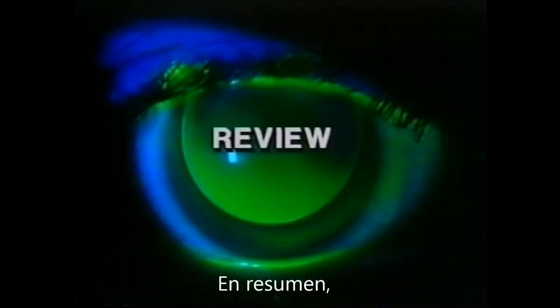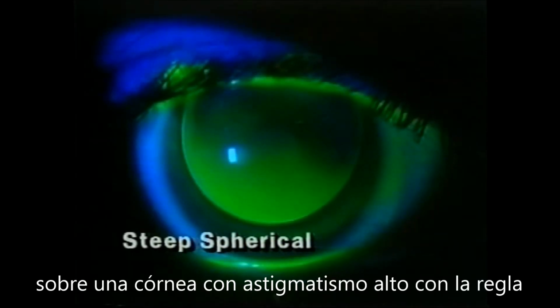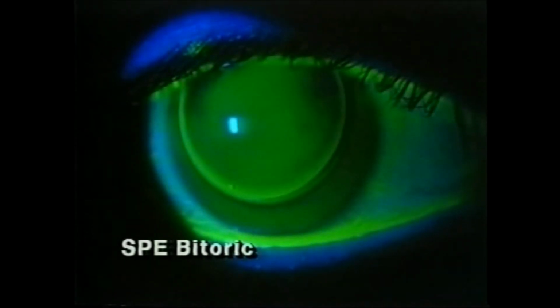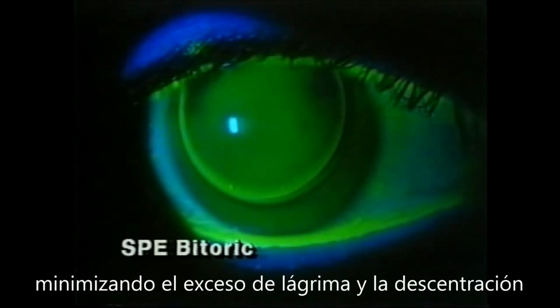In review, a spherical base curve radius lens fit on a high with-the-rule corneal astigmat often results in poor centering and an unacceptable lens-cornea relationship. The use of a back surface toric or bitoric lens design will provide more of an alignment fit, minimizing the effects of rocking and decentration.